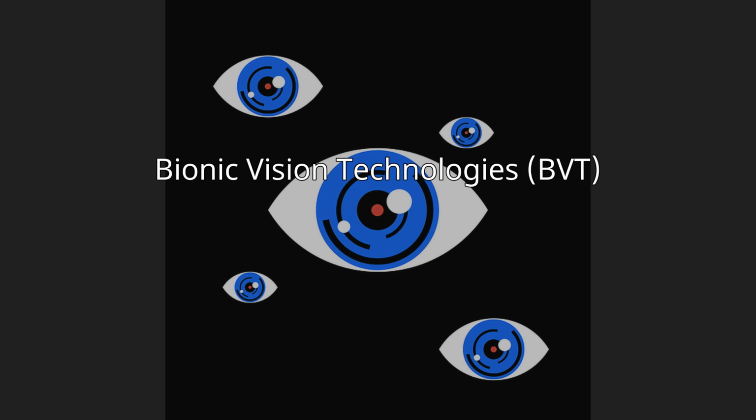BVA was also concurrently developing the high-acuity device, which incorporated a number of new technologies. The device aimed to provide functional central vision to assist with tasks such as face recognition and reading large print. This high-acuity implant would be inserted epiretinally. Patient tests were planned for this device in 2014 once preclinical testing had been completed. It is unknown whether these trials ever took place. Patients with retinitis pigmentosa were to be the first to participate in the studies, followed by age-related macular degeneration.